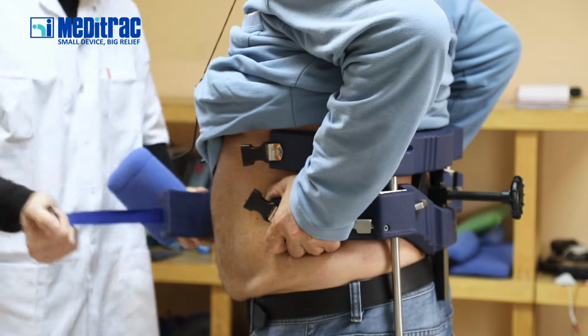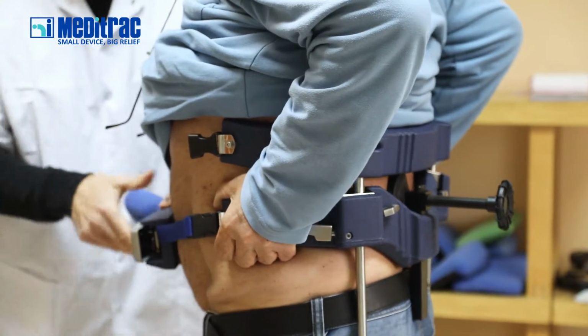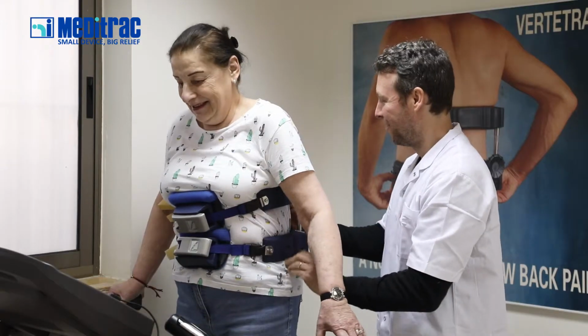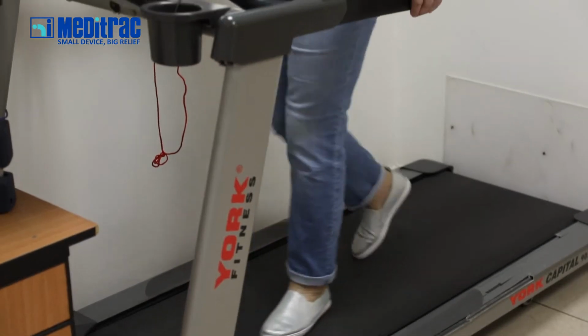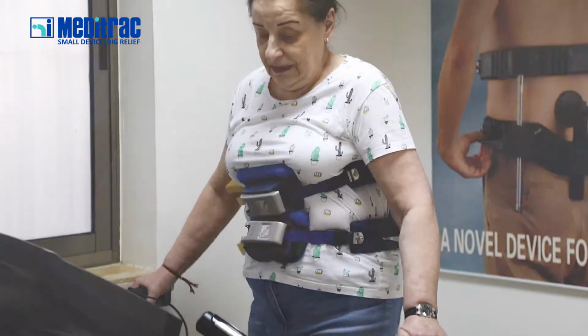The upper frame should fit around the patient's rib cage with no clothing, body parts, or other obstructions between the frame and the rib cage. Please note that when treating large-breasted patients, the patient's breasts should be resting above the upper frame and not trapped between the frame and the body.